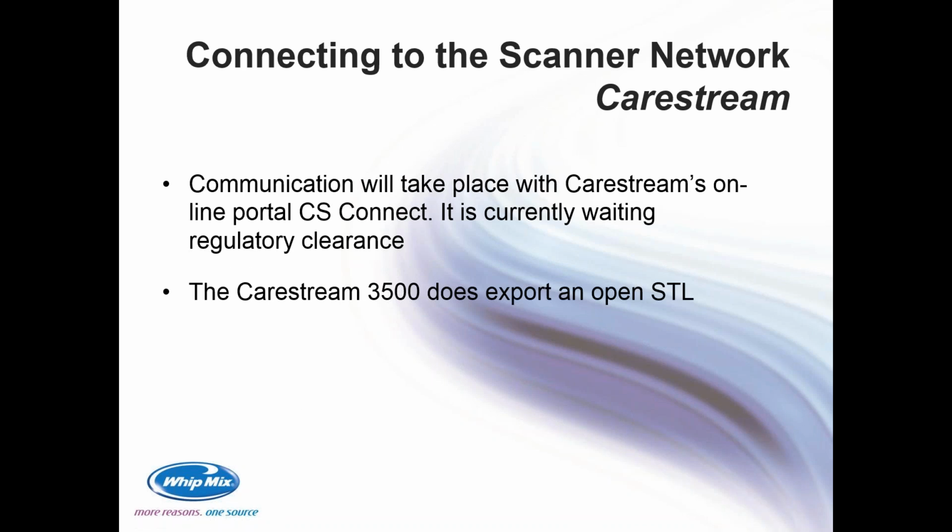So connecting the scanner network at Carestream, and this is what I had said earlier, I'm not exactly sure where they are. Communication is going to take place on Carestream's online portal. It's going to be called CS Connect. The last I heard, it is actually still currently waiting regulatory clearance. So I don't believe it is up and running, but when it is, that is going to be their communication platform or their network for communicating with third parties.